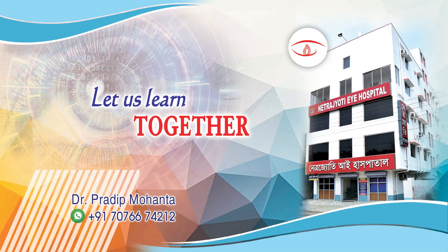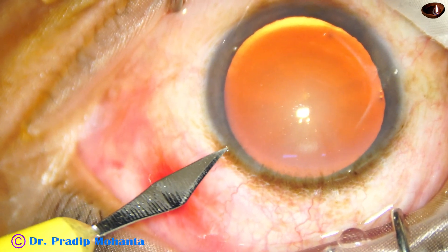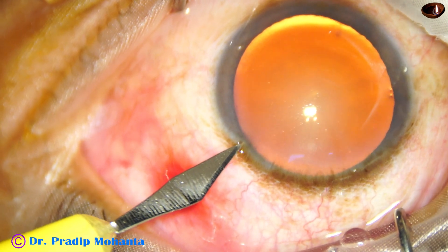Welcome to my workplace at Ranagh Heart, West Bengal, India. This video is for the eye surgeon who has been doing SICS and now wants to attempt phaco.